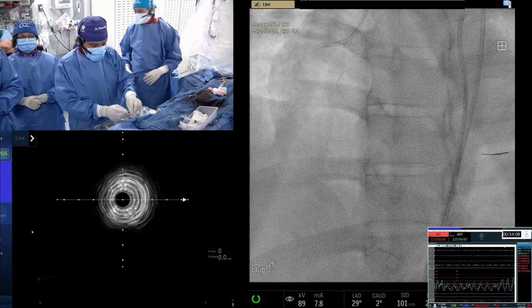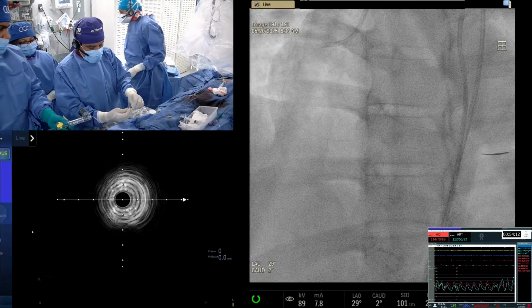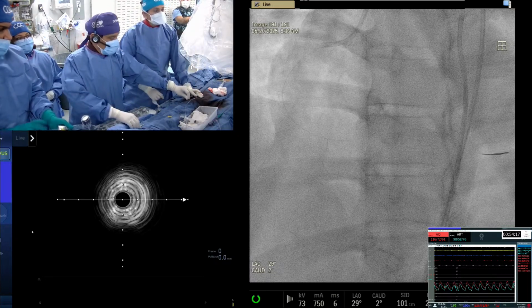We're showing it. Once you're there, here. So question is, you go forward. Good. Keep going up. Fluoro.